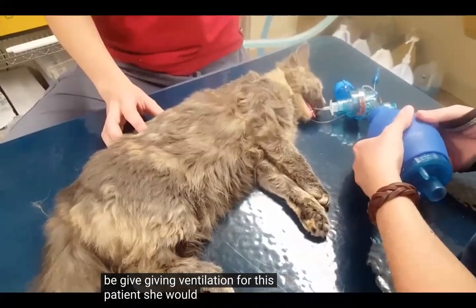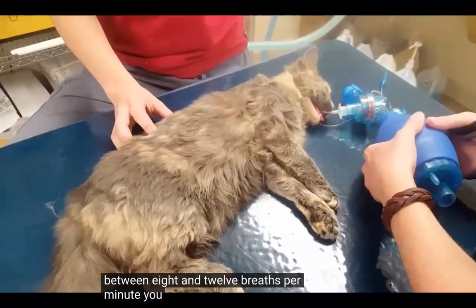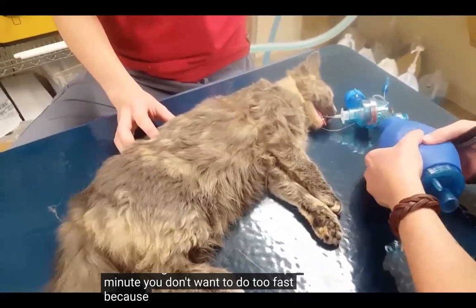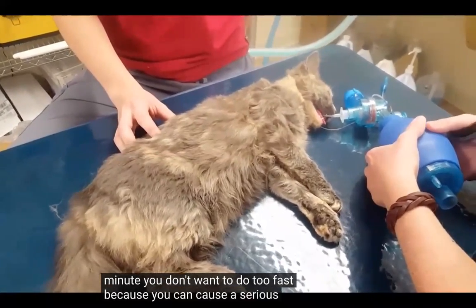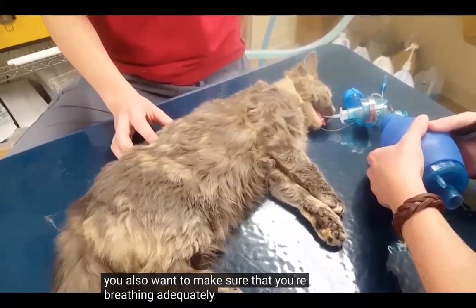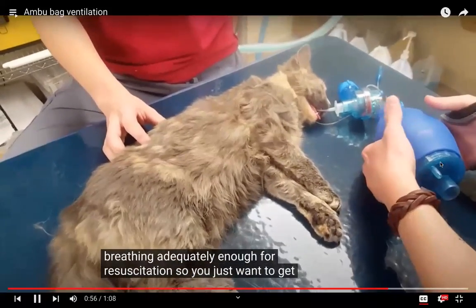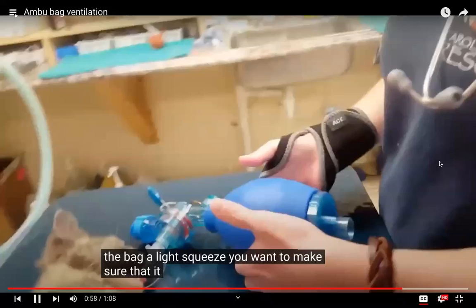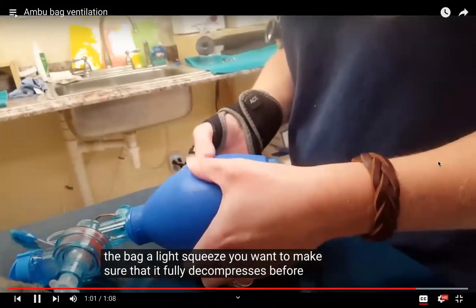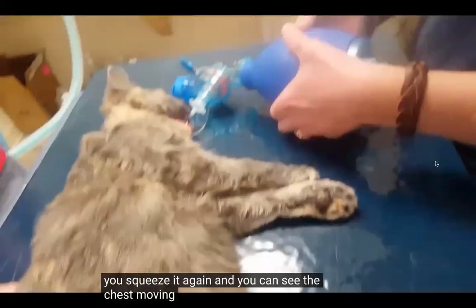For this patient, she would want to get anywhere between 8 and 12 breaths per minute. You don't want to go too fast because you can cause some serious neurological damage to the patient, but you also want to make sure that you're breathing adequately enough for resuscitation. So you just want to give the bag a light squeeze. You want to make sure that it fully decompresses before you squeeze it again, and you can see the chest moving up and down.